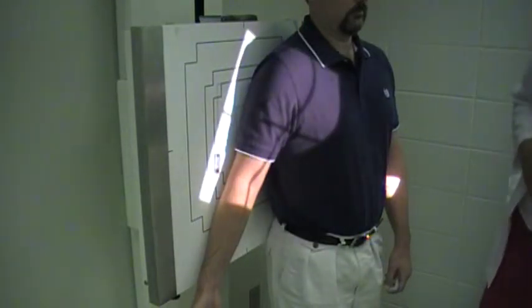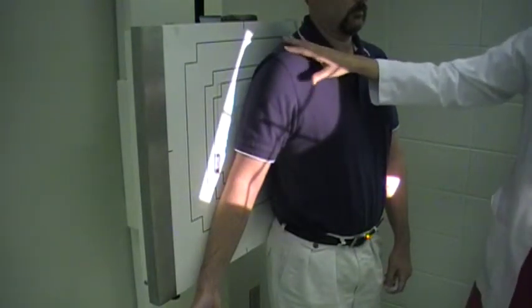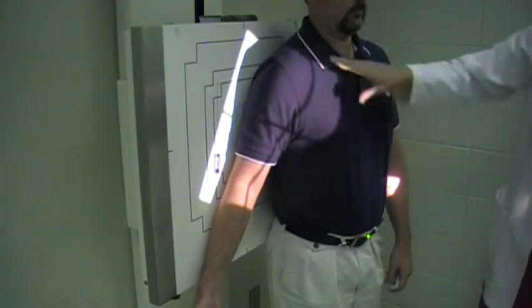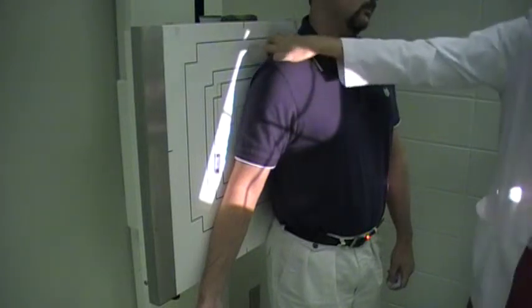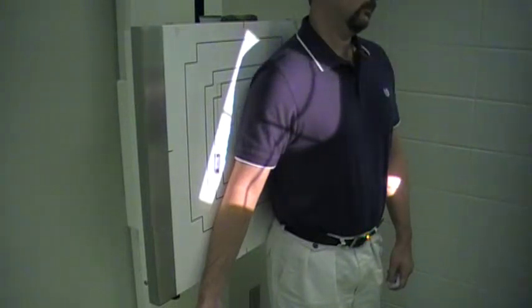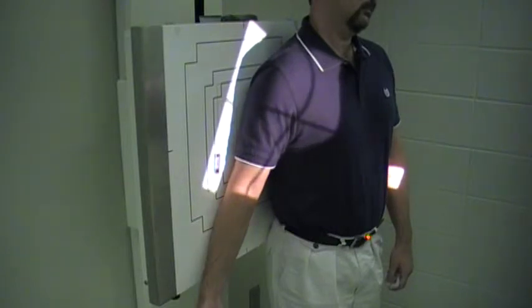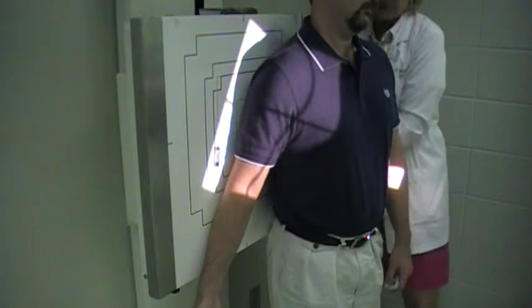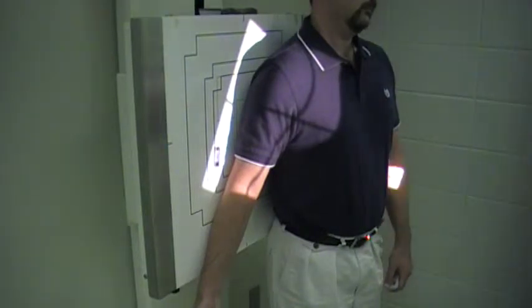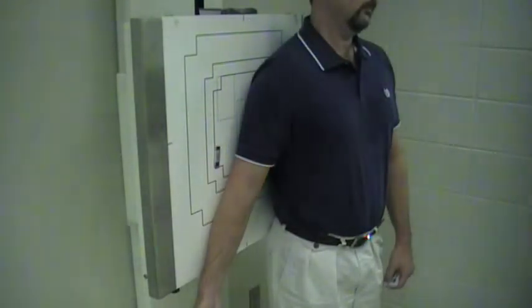One other adjustment is to make sure you do get the shoulder joint in there. Either have the patient relax the shoulder down because you want to see the upper border, or you can raise the tube up just a little bit and then raise the bucky up as well. That's our AP projection.